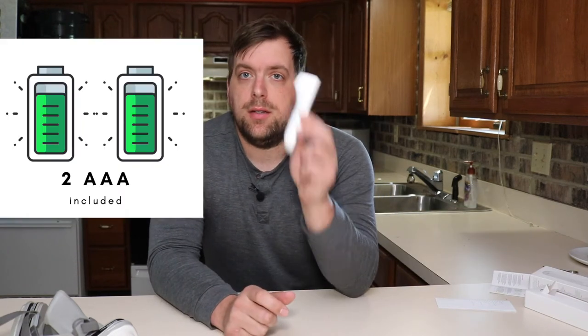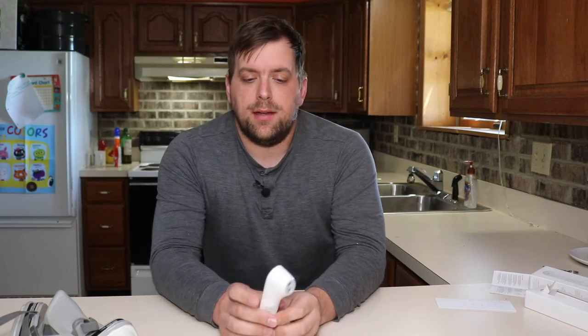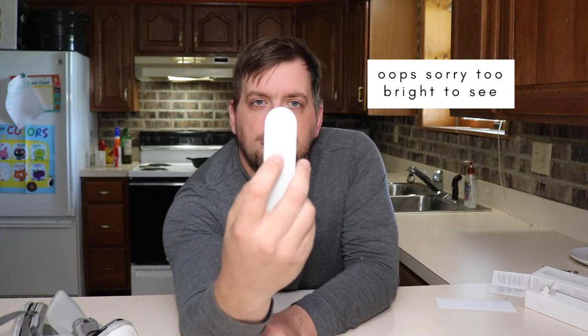You put in the two AAA batteries that come with it, and you push it to wake it up. When you see that on there, you're good to go. Place it about an inch off your forehead, in the middle of your forehead.